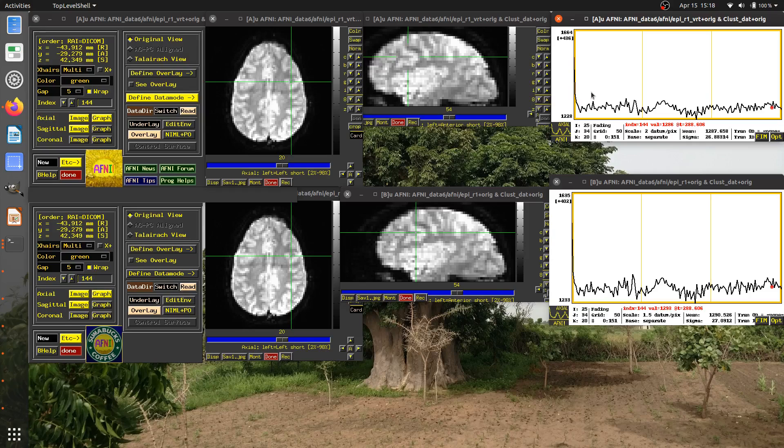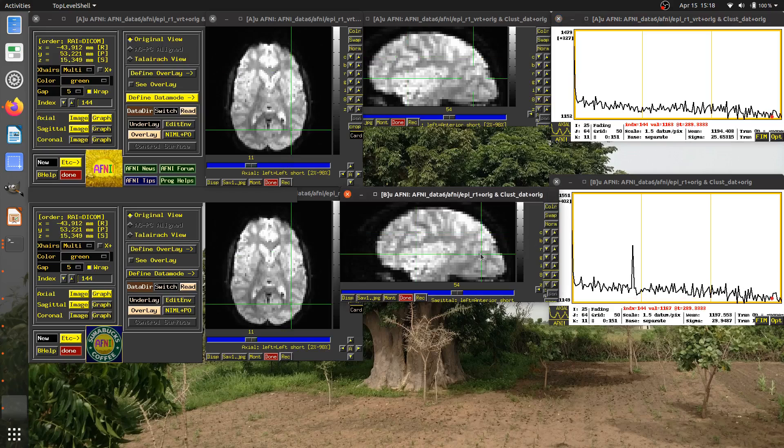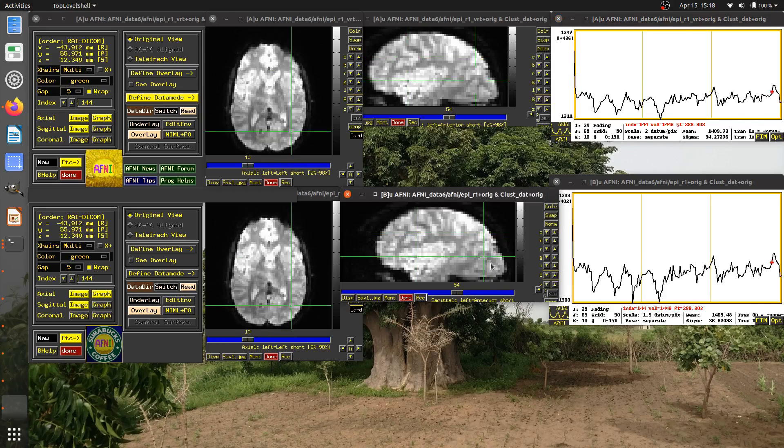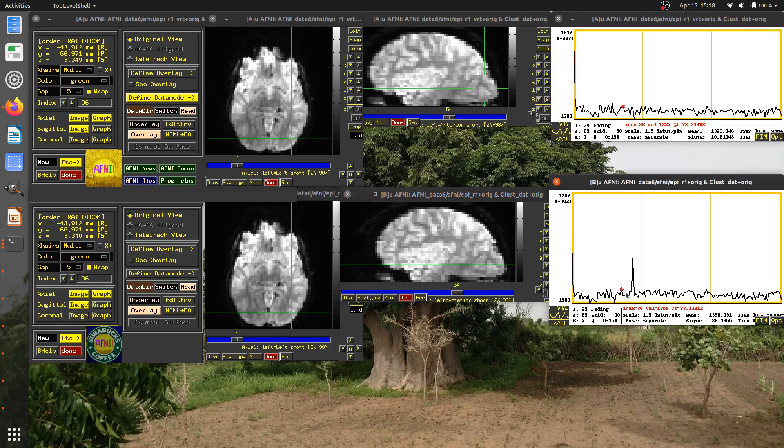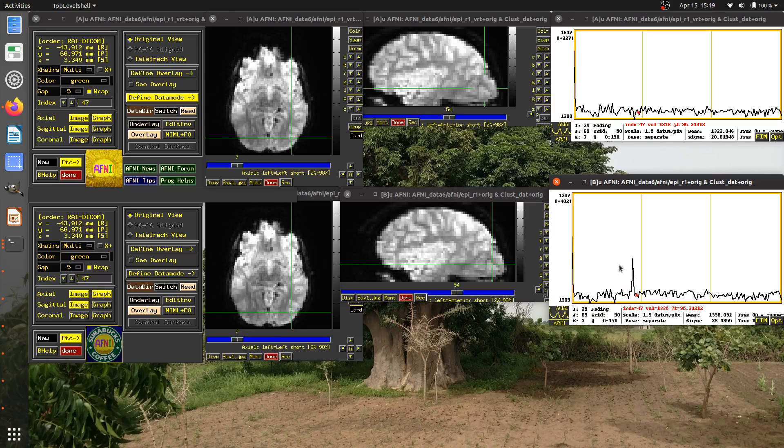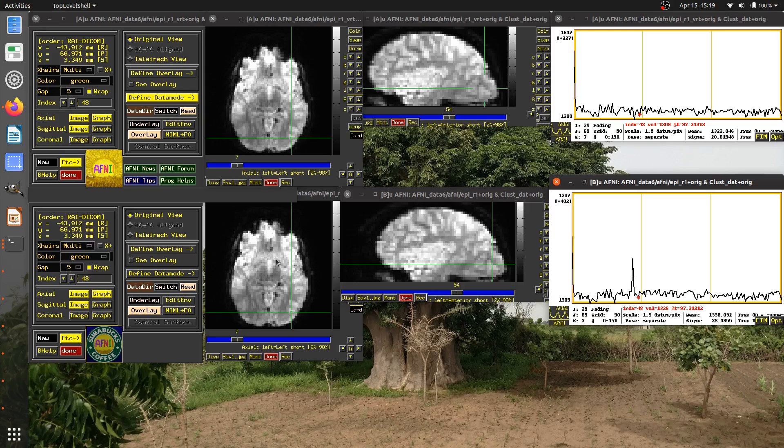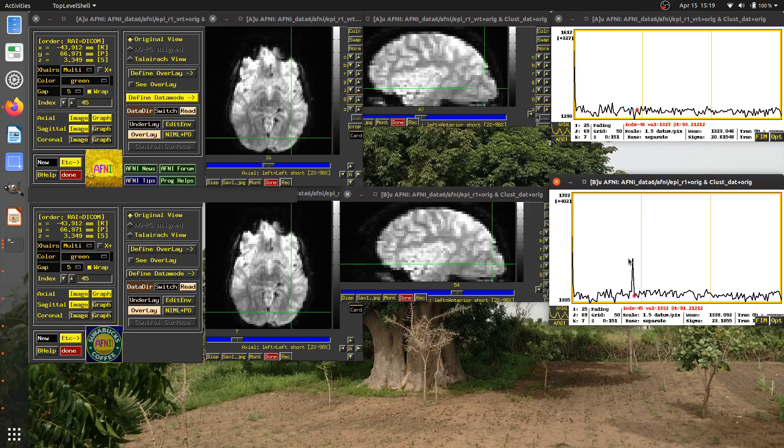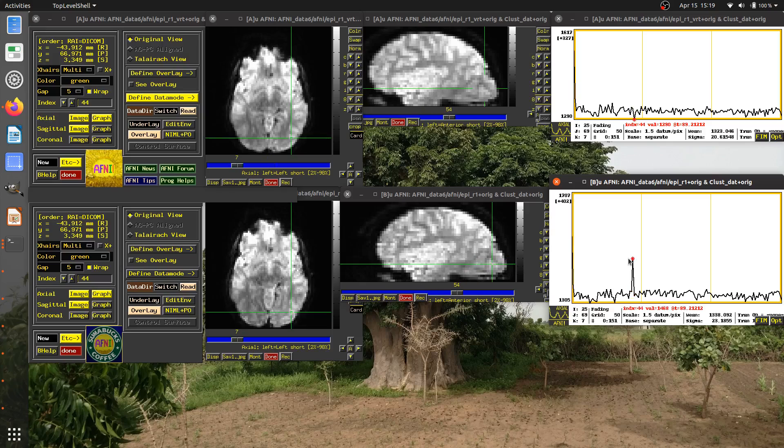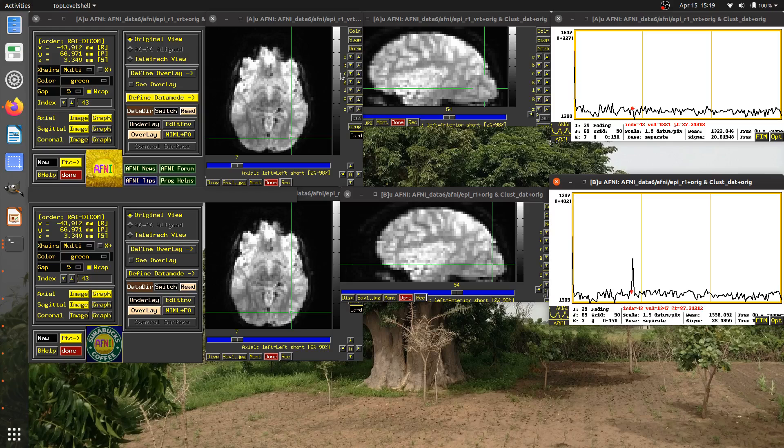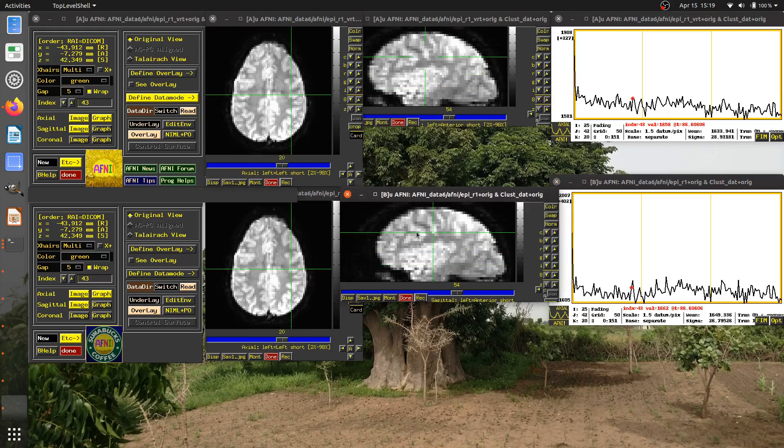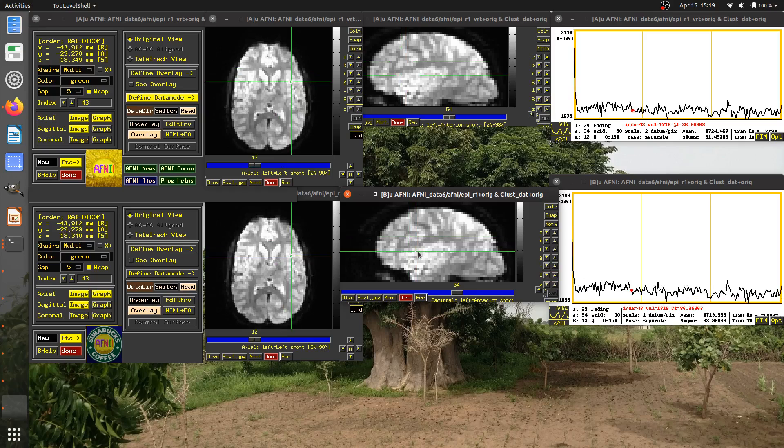Now, why is this particularly useful? Well, this dataset has some interesting features here. This dataset has not been motion corrected, and this one has been with 3D Volreg. If I just use the arrow keys around this feature, you'll see this is a nice way where you can see motion before and after correction. So they're time locked now.